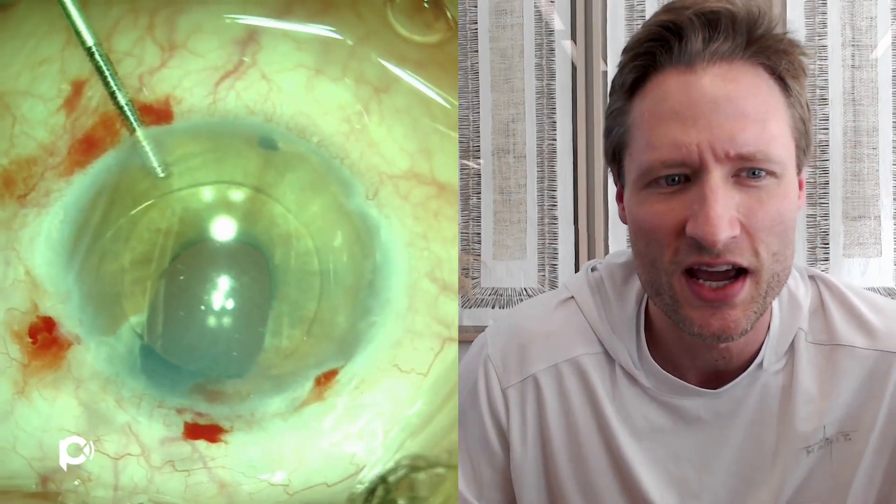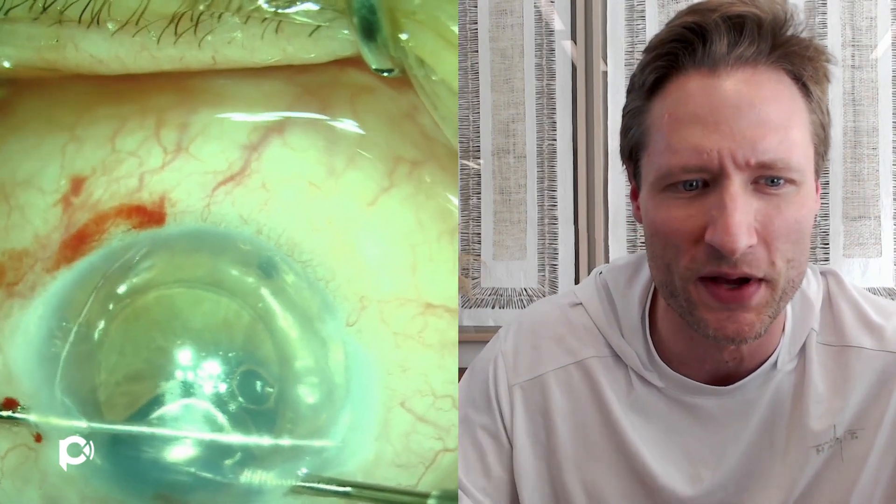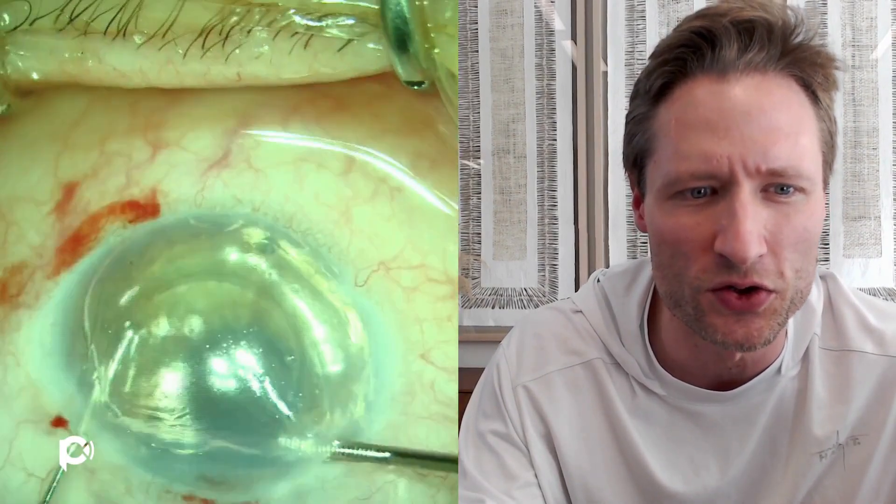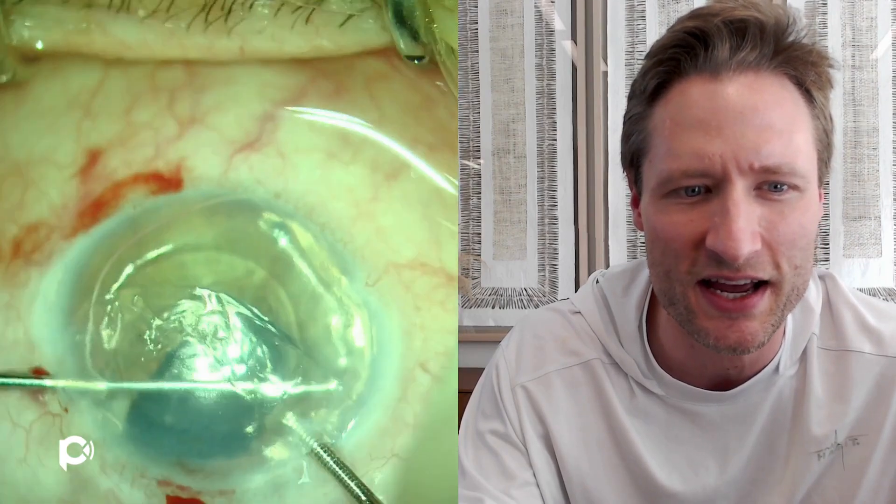I do that with the assistance of an AC maintainer — here I'm insinuating it into the eye. First I'm making a little inferior iridotomy with a vitrectomy handpiece. The AC maintainer is 23-gauge and keeps the anterior chamber formed with air during the descemetorhexis, which really helps with stability during scoring and stripping. Here I'm using an inverted Sinskey hook to score the back of the cornea, then peeling toward the center to liberate the Descemet membrane as a single sheet. I'm fast-forwarding through this since it's completely normal and standard.